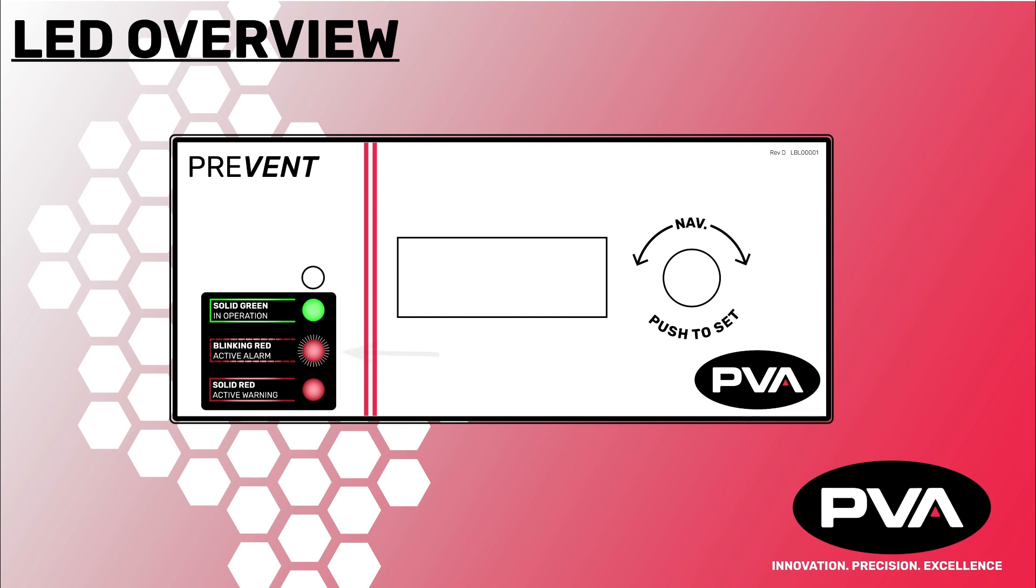If the LED button is blinking red, it will indicate there are active operational alarms. You will also hear an audible buzzer. If the LED button is solid red, it will indicate there are active operational warnings.